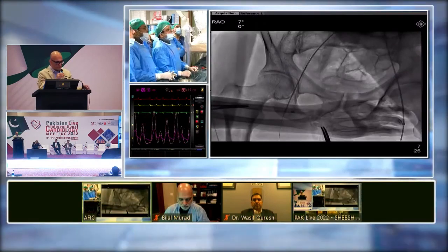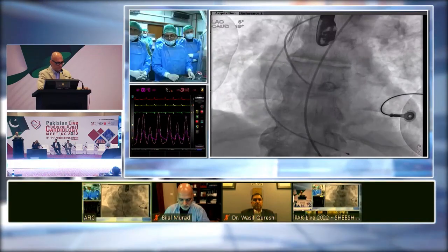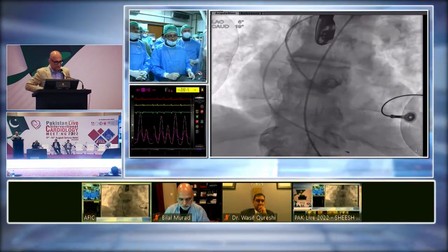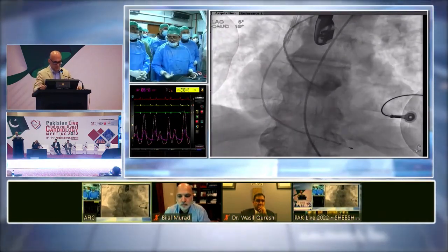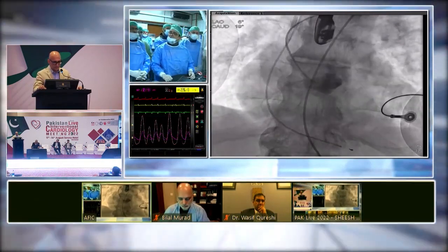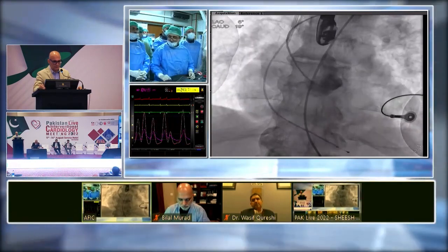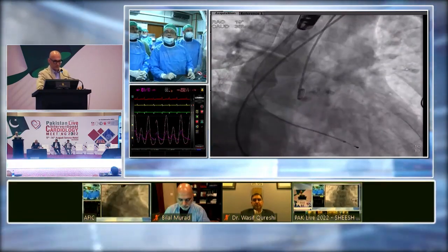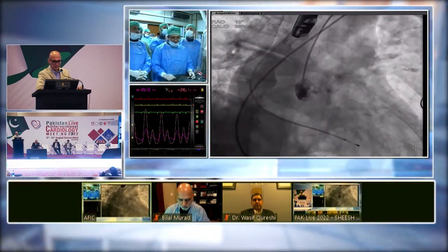Do you always have a safety wire for your cases? And what's your choice of wire for that? And your patient is conscious sedation? So that's a very good question. So the plan up till this morning was conscious sedation, but the patient was very anxious this morning.